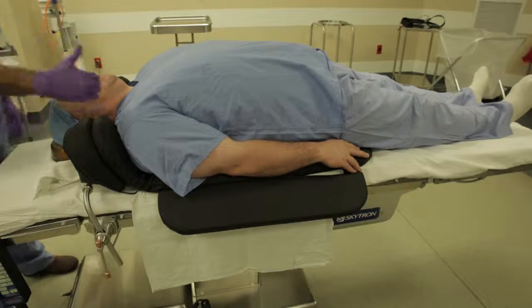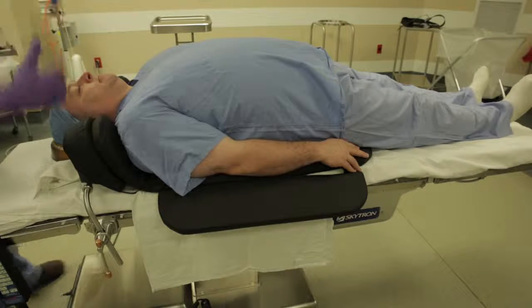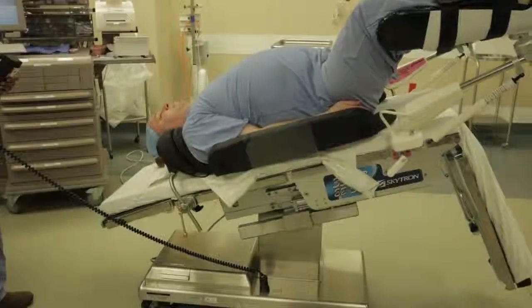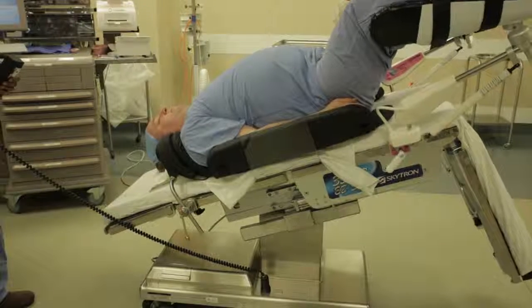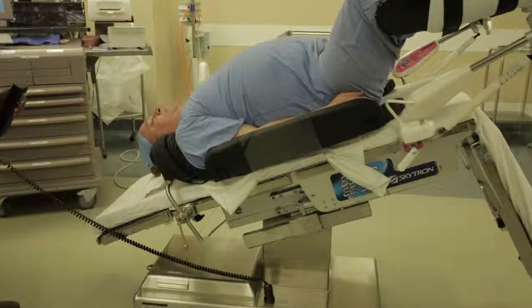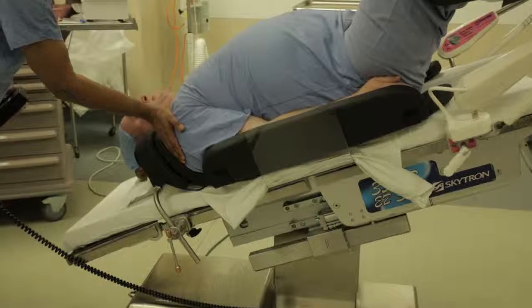You can ask if the patient is comfortable and make any necessary adjustments with the help of the ambulatory patient. When the patient is positioned properly, there will be a small space between the top of the shoulder and the TPS gel pad. The clinician can ensure there is minimal pressure exerted on the brachial plexus by placing their hand in the space.